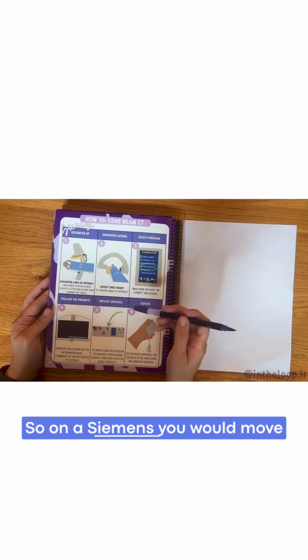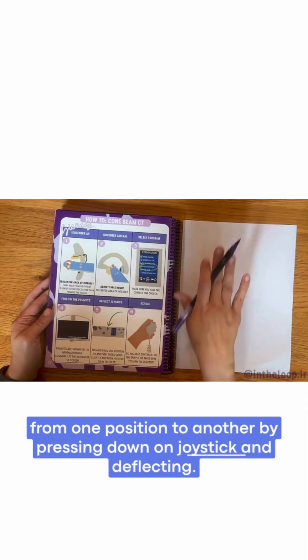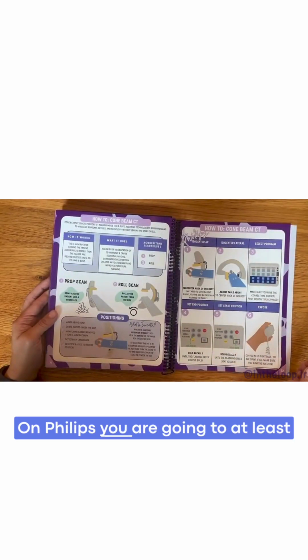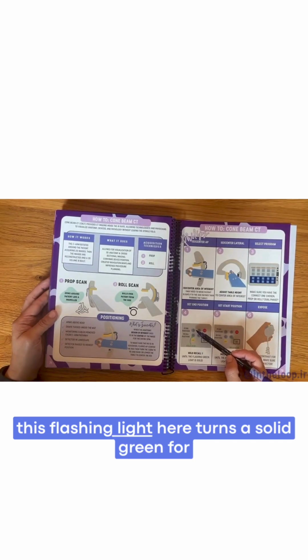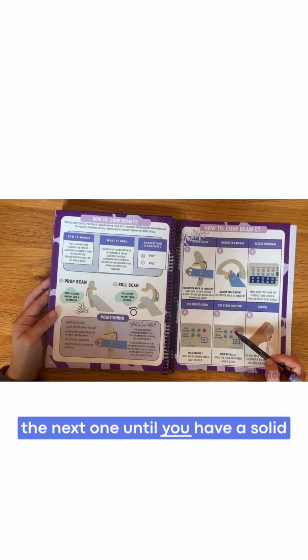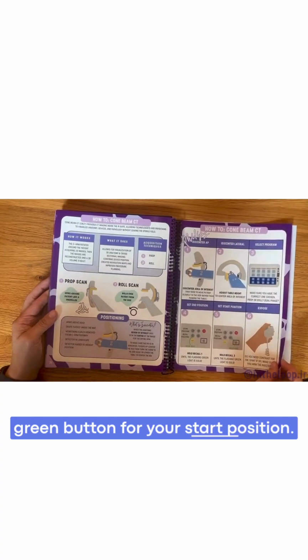On a Siemens, you would move from one position to another by pressing down on the joystick and deflecting. On Philips, at least on this version, you are going to hold the recall position until this flashing light turns to solid green for your stop position, and then you're going to hold the next one until you have a solid green button for your start position.